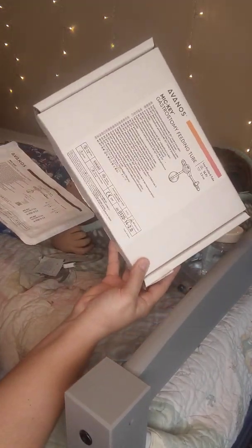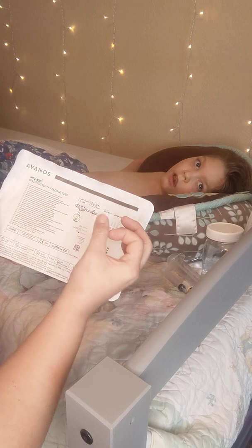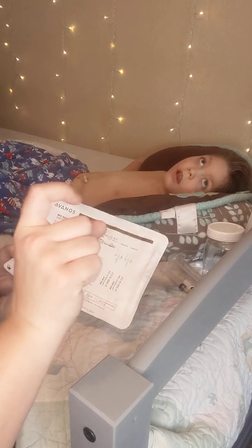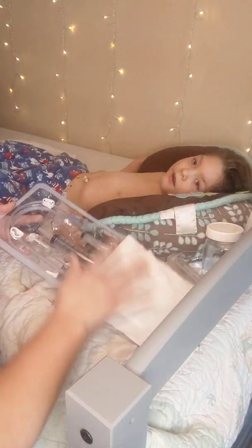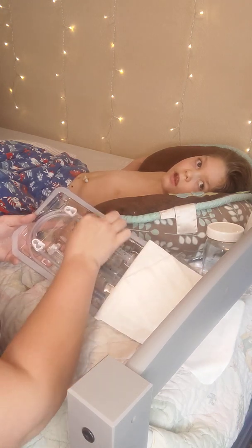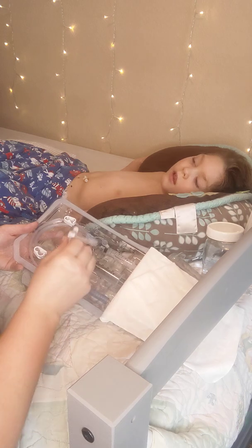Your G-tube button will come in a box like this. His is a 14 French 2.0 centimeter. 14 French is the diameter, and the 2.0 centimeters is the length that's going into the stomach. When you open it, it could differ, but this is what it'll look like inside. You'll have a syringe for the balloon valve, a couple of extensions, a Mickey extension, and a bolus. You'll have the actual G-tube button that you'll be replacing, all nice and new.